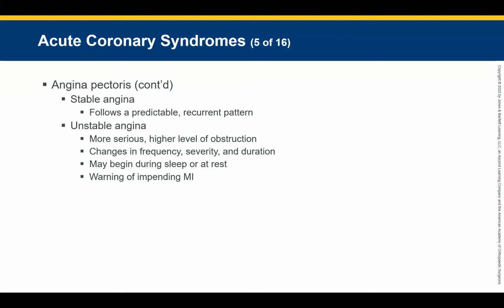Yeah, we don't have 12 leads, so we don't know it's a STEMI. Could be having a STEMI, but the most right answer is unstable angina. Could he be having a STEMI? Yes, we need a 12 lead for that. Unstable angina because it didn't get better with treatment, with nitro or rest. Okay, we know he has a history of it because he has nitro in his pocket.